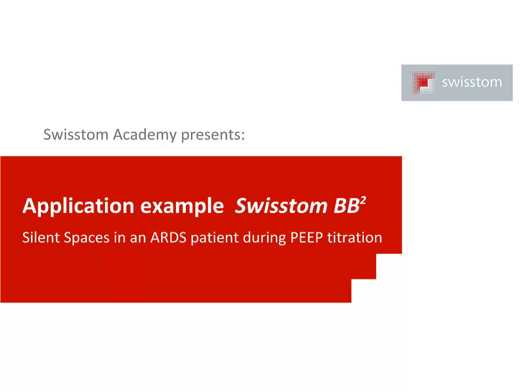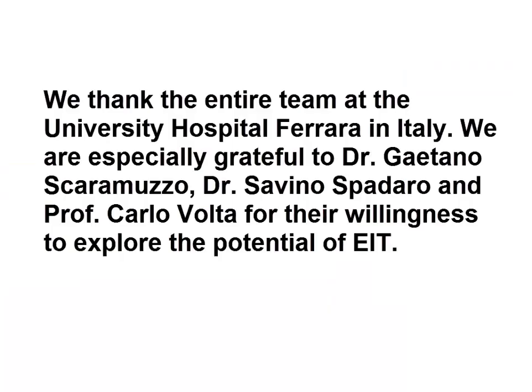In this video, we're presenting a PEEP titration in an ARDS patient whose regional lung function was monitored by electrical impedance tomography. The recordings were performed at the St. Anna Hospital of the University of Ferrara, Italy. We thank Professor Volta and the entire team at the University Hospital Ferrara. We are especially grateful for their willingness to explore the clinical potential of EIT.